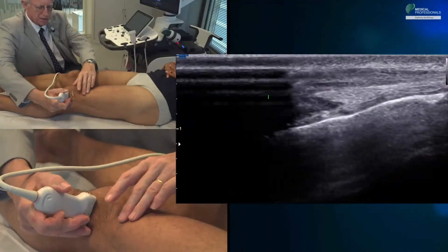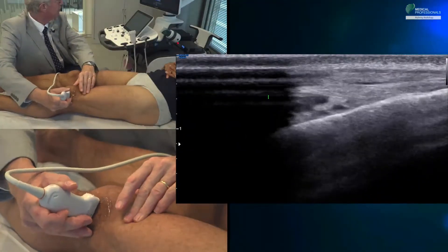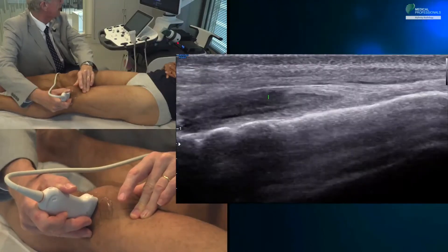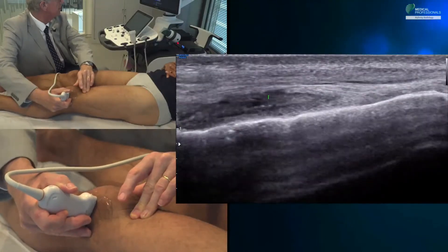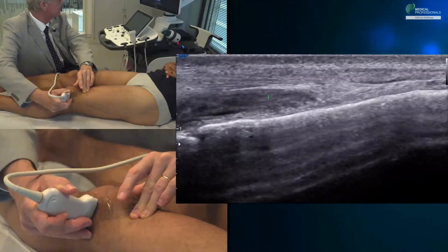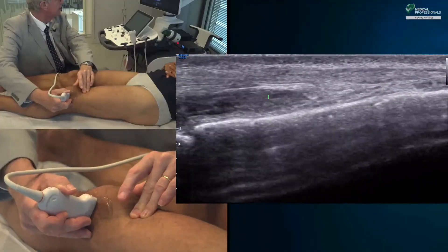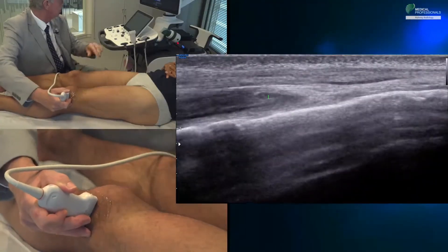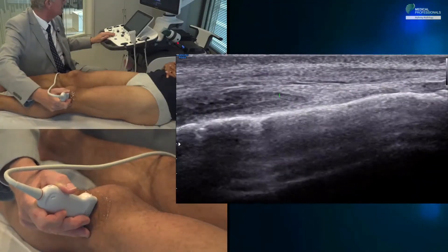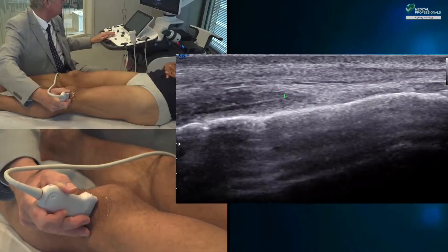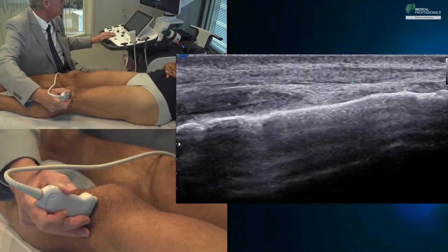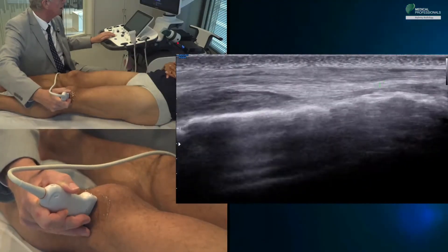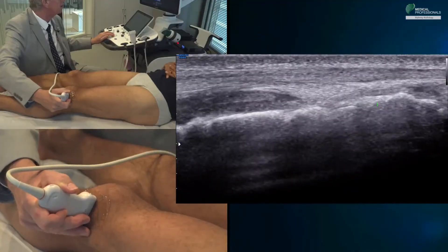For this reason, we push the patella slightly lateral to open the cul-de-sac. We see here that the lateral portion of the cul-de-sac does not extend too far laterally — it remains in the anterior part and does not insinuate itself between the band and the femoral condyle.